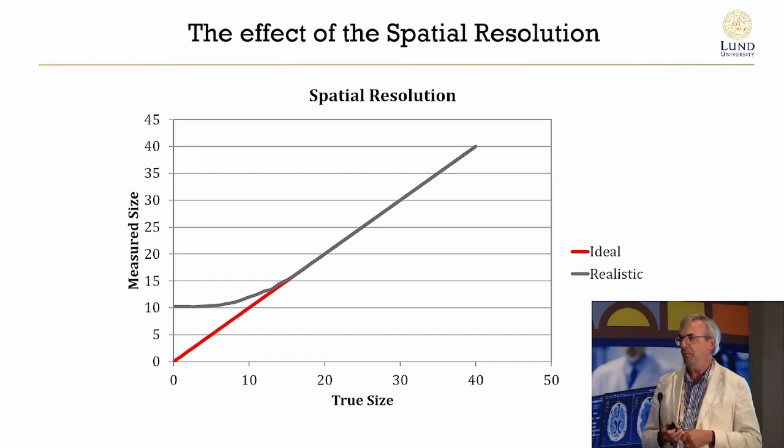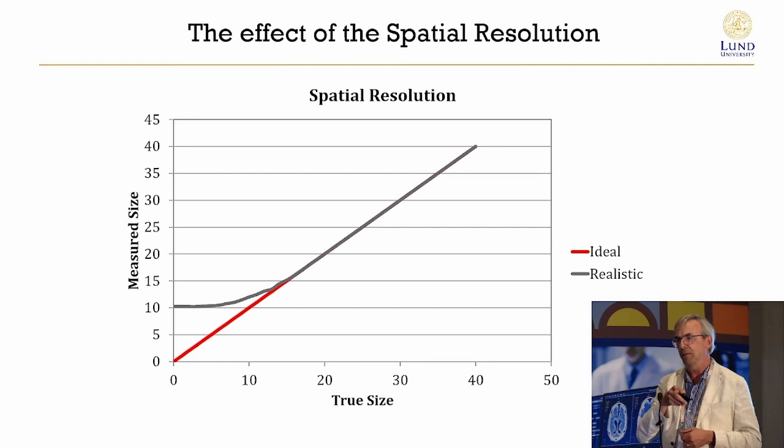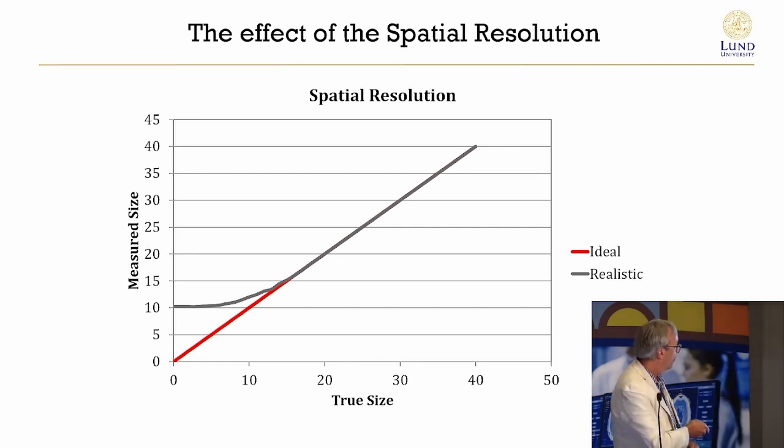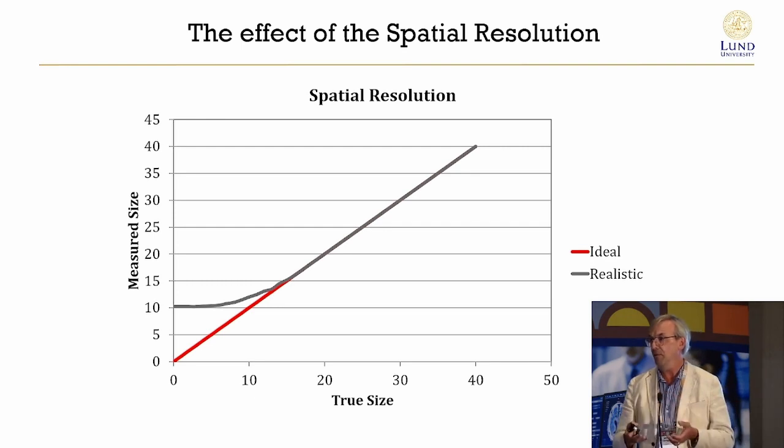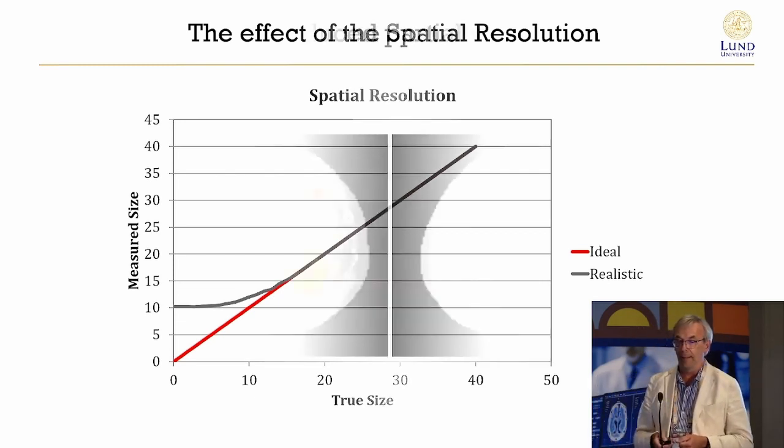And when you come to absorbed dose calculation, you want to calculate energy over a volume with a certain mass. But the problem with the SPECT camera is that when you go down in volume, there is one stage where you cannot resolve smaller volumes. And that is when you're reaching the spatial resolution. So even if you have very small volumes, you get the same volume in the image when you reach the system spatial resolution. So you can't calculate a smaller volume than your camera allows.